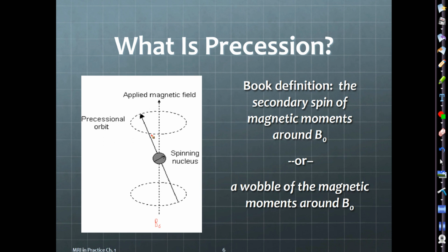So it's just a secondary spin when you have a charged particle in motion around a magnetic field. But yes, you could say that for sure, having an orbit around something that's already spinning on its axis. But I would think of almost that as like an electron spinning in its orbital shells, you know what I mean? So maybe just a little bit different.